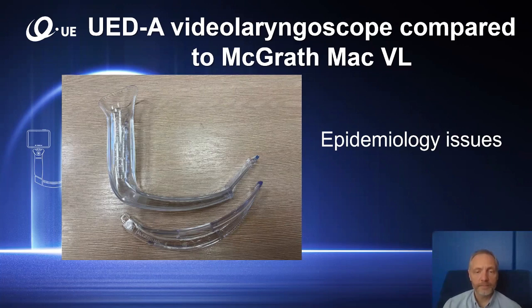So, of course, we can say that video laryngoscopes should be cleaned properly after each use, and the probability of crossover infections is very limited. However, it may happen that because of some other additional factors, the handle of the video laryngoscope cannot be cleaned properly.